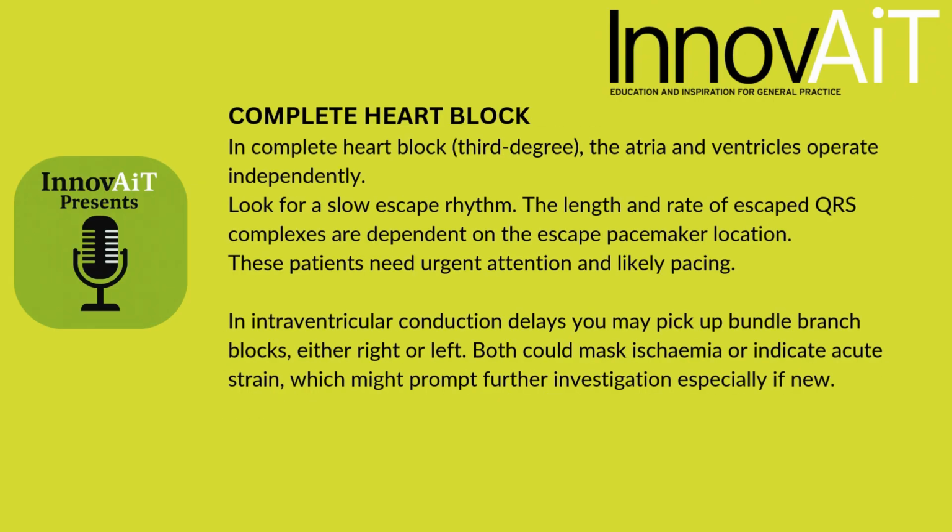In complete heart block, third degree, atria and ventricles operate independently. Here, look for a slow escape rhythm. The width and rate of escape QRS complexes are dependent on the escape pacemaker location. These patients need urgent attention and likely pacing.